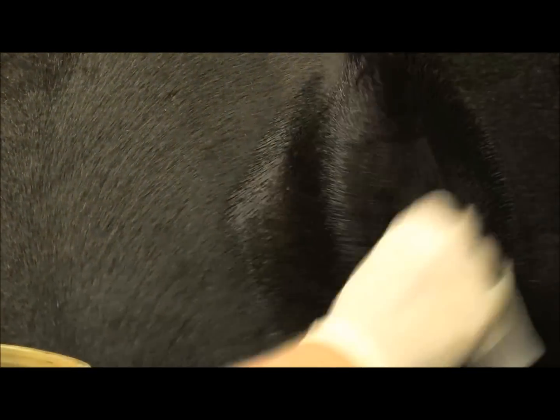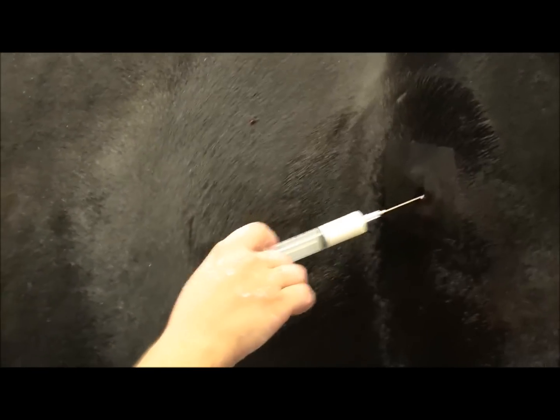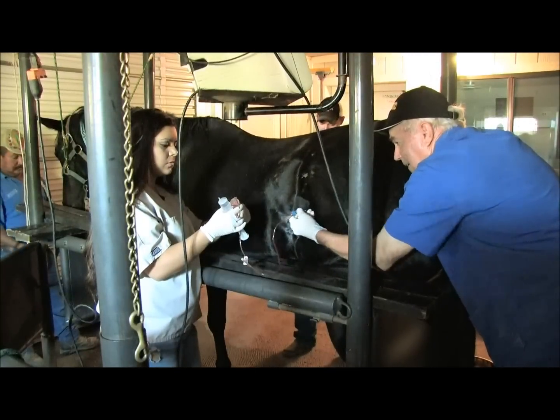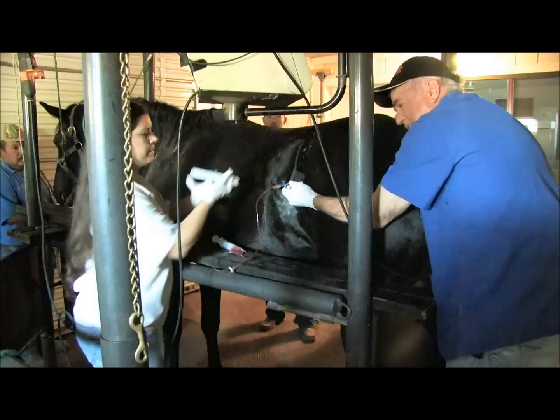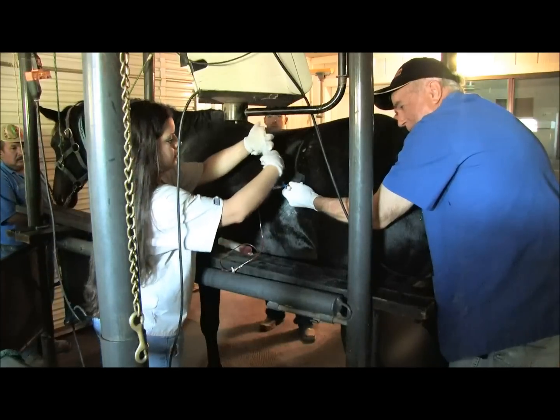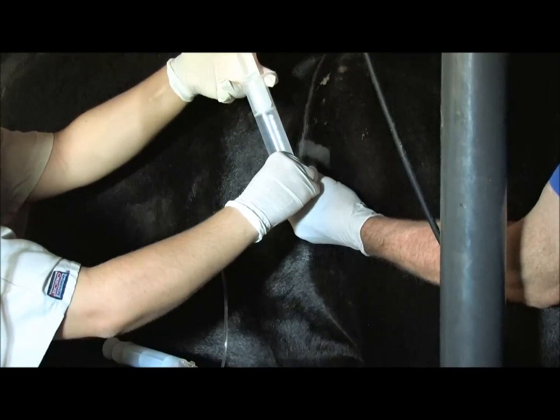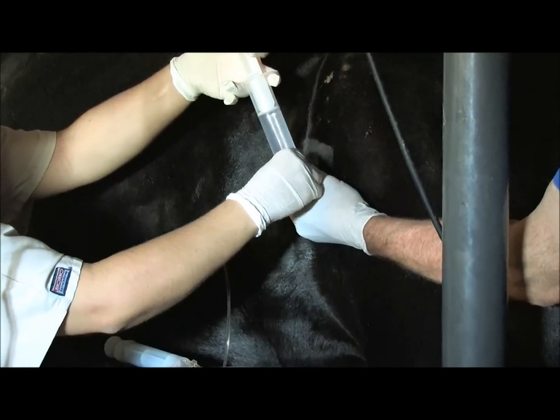We perform our oocyte aspirations through the flank of the mare. The location on the flank is determined by the position of the ovary and the abdomen. The site has a surgical prep, it's blocked with lidocaine, a trocar is inserted and our aspiration needle is inserted through the trocar.